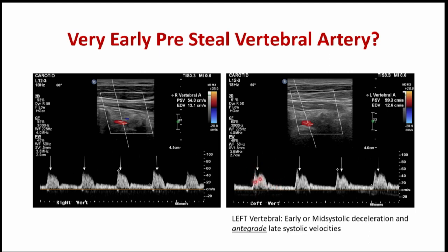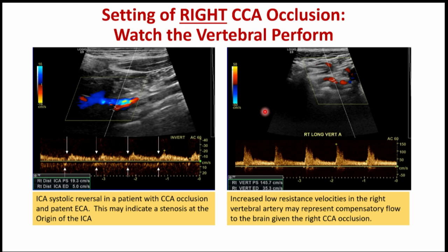Some people call these rabbit-shaped waveforms. Well, you just look at that dip and you want to compare it, and you're going to notice that that's a very early pre-steal waveform.